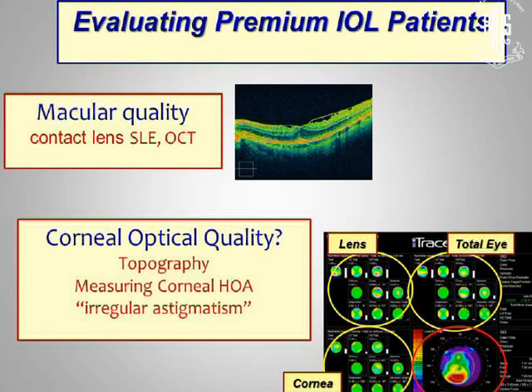You're going to hear about the macula. Think about how OCT allows us now 10 micron resolution to get all this information about the macula. But yet we go into this knowing so little about the cornea. And that was the theme on some of the previous talks. So I'm going to talk to you about the eye trace.